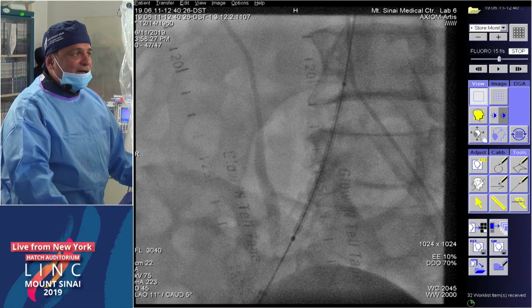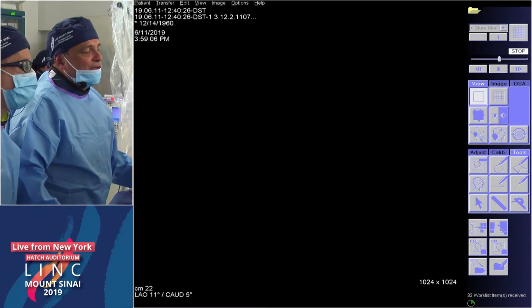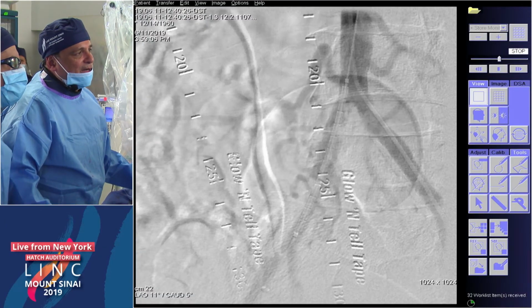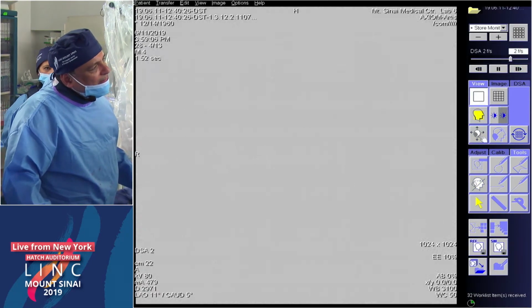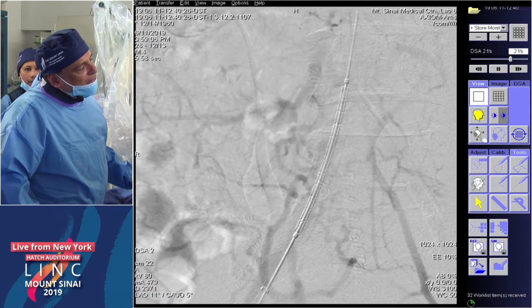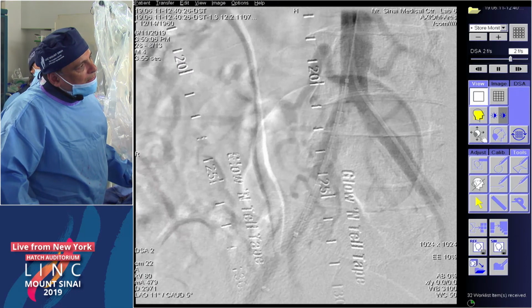I'm going to do a DSA whenever Asma is ready. Oops, sorry, I hit the wrong button there. And then we're going to make sure we hit the ostium. Go ahead, inject. I don't think we need to do kissing here, Jim. So we're going to hit it one at a time if you're okay with that. I prefer to align them next to each other. That's my approach usually. I like this where you're really concentrating on where that hypogastric is.